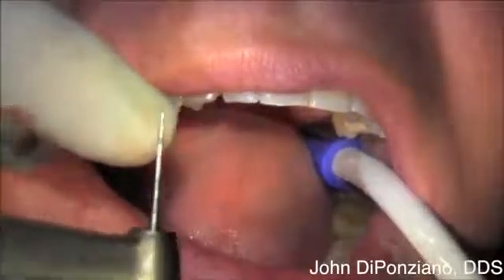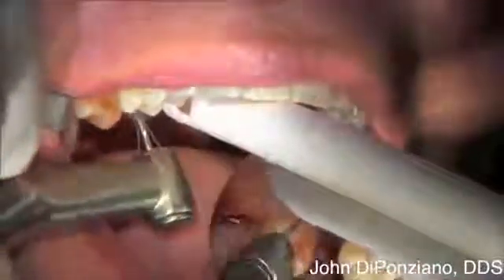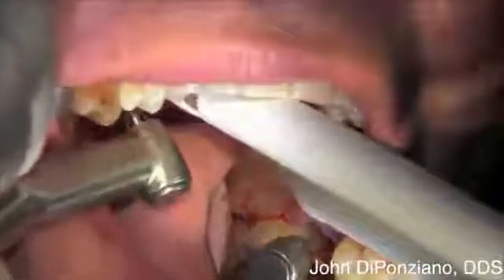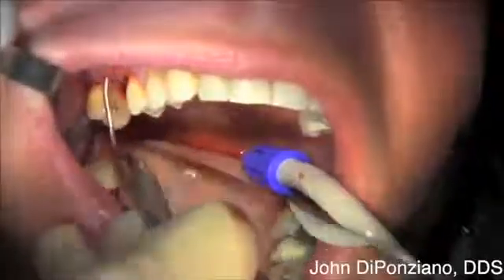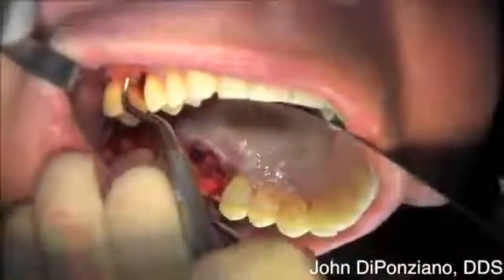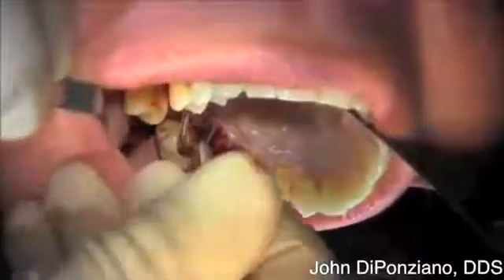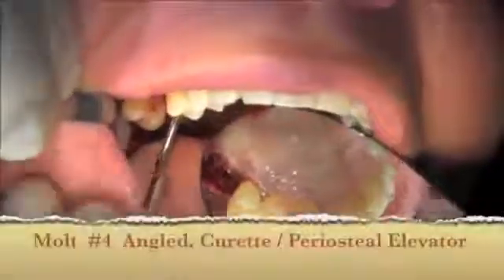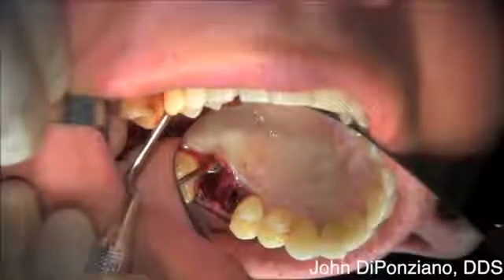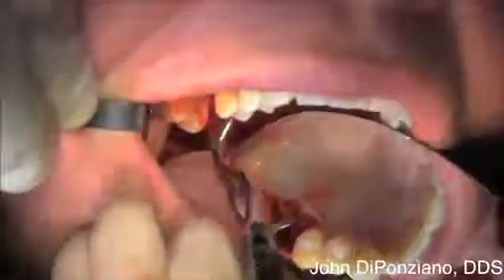Using that same Comet burr — it's very smooth — to actually smooth down and plane the root. There's a mesial defect on that number two molar, so this is also cleaning out that defect to get down to sound bone. We use that same number two angled curette to release the periosteum on the facial flap, and on the palatal flap we use a number four, which is a little bit broader blade for the heavier tissue to undermine the tissue and release the periosteum with that flap.